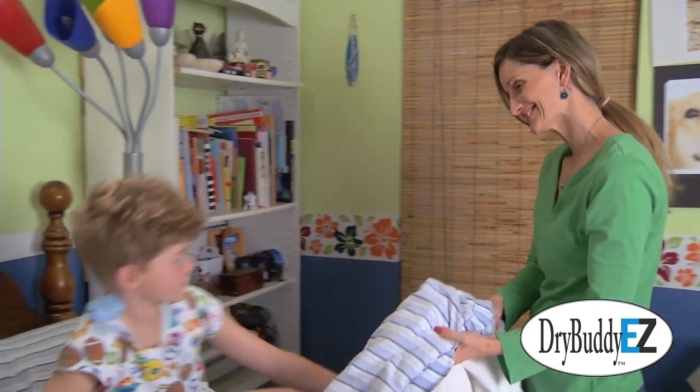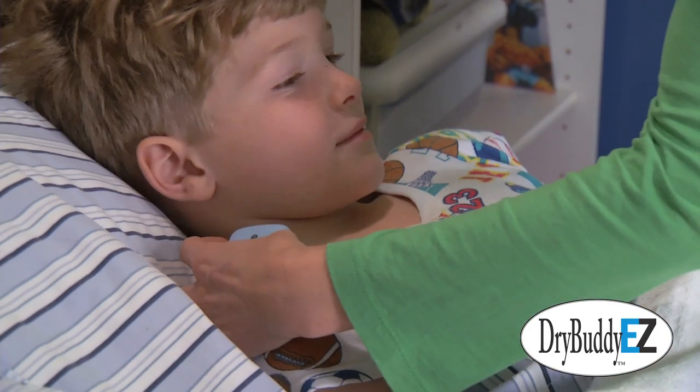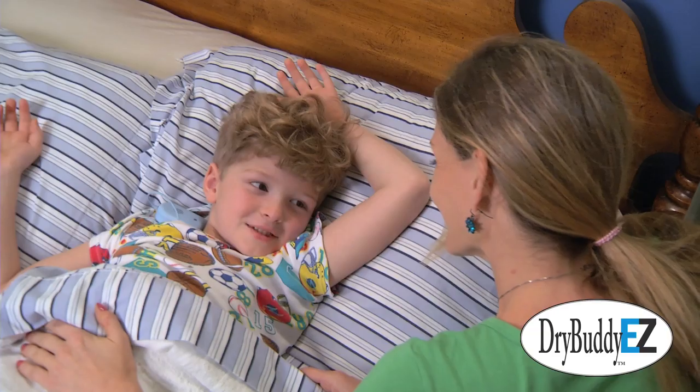This worked so well that David has overcome his bedwetting problem and has regained confidence and self-esteem. He now goes for sleepovers, camping, and other activities without any worries. Aren't you glad we got the Dry Buddy EZ, sweetie?